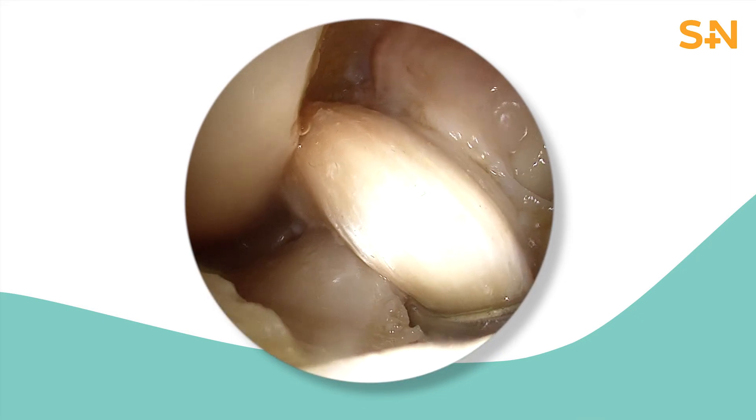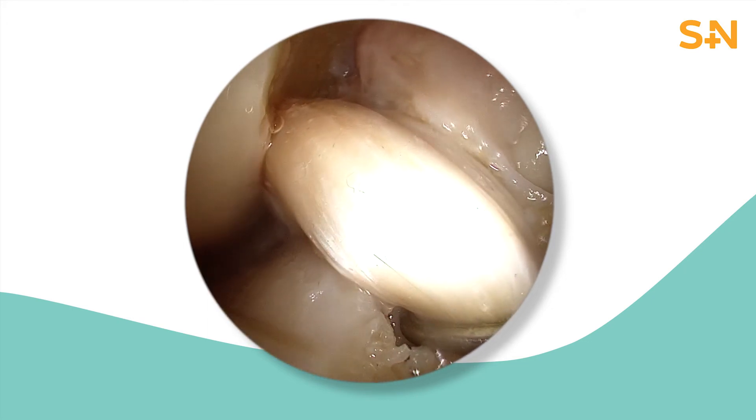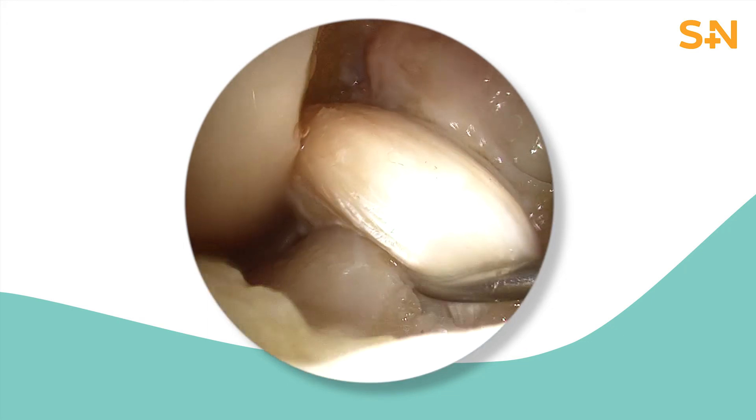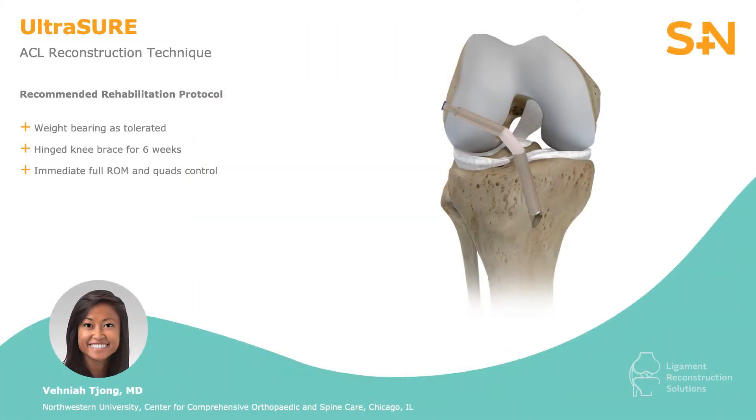Arthroscopic view of the ACL ensures that the graft is taut. Any remaining tension can be adjusted through the loop suture of the ultra button proximally, and full extension is viewed to ensure there is no graft impingement. Post-operatively, the patient with an isolated ACL reconstruction will be weight-bearing as tolerated in a hinged knee brace for six weeks, with full range of motion and quad control to begin right away.